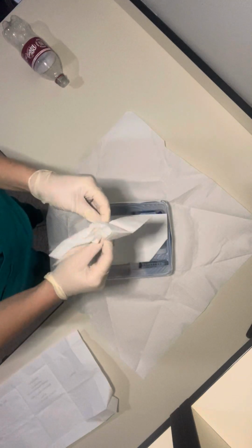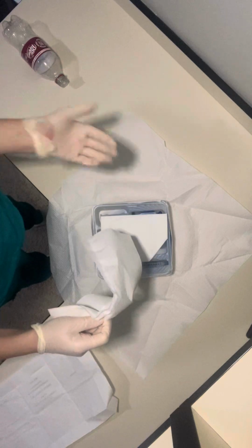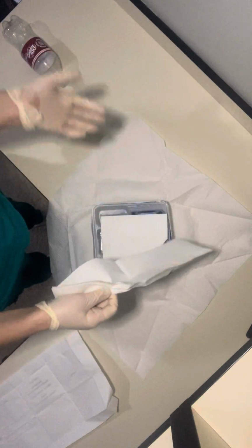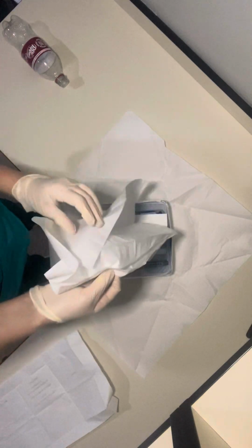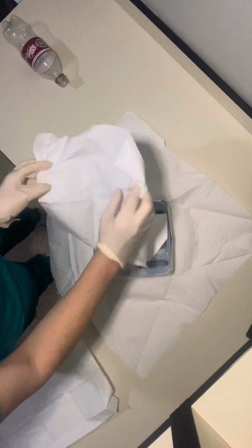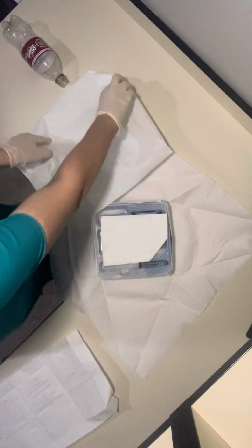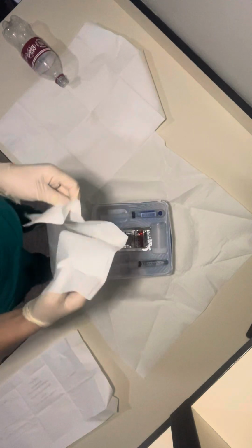Then I would open the drape. And so I would make sure that my body's not touching my sterile field. But again, it would be easier if I had the table and was able to have everything up higher because I'm kind of tall. Okay. And so we're just going to place the drape, and we'll let it fall not to touch the patient.